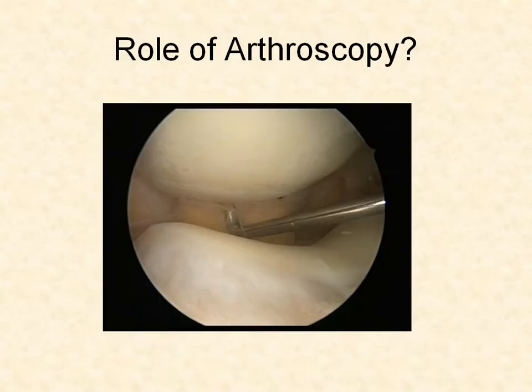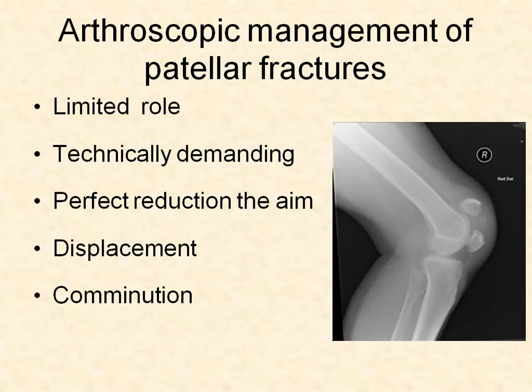I was asked to address the role of arthroscopy. Well, the role of arthroscopy in the management of these fractures in my own practice is absolutely nil. I do not use it at all. I do a lot of knee arthroscopy, and I'm quite happy with the technique for many orthopedic conditions, but I think that here in patellar fractures it probably has a very limited role.